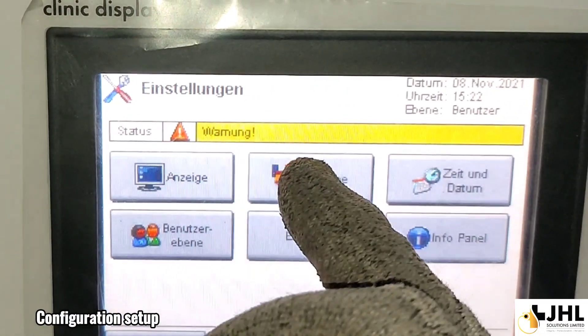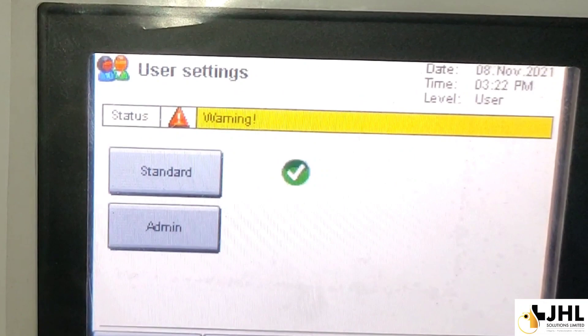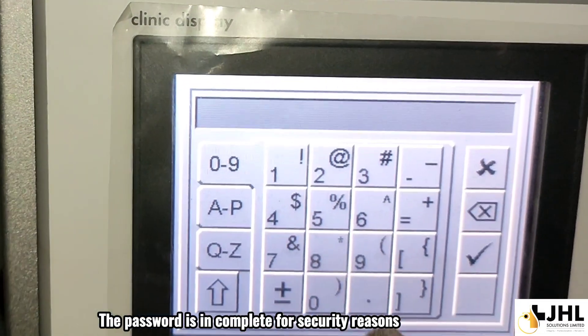Configuration setup. The password is incomplete for security reasons.